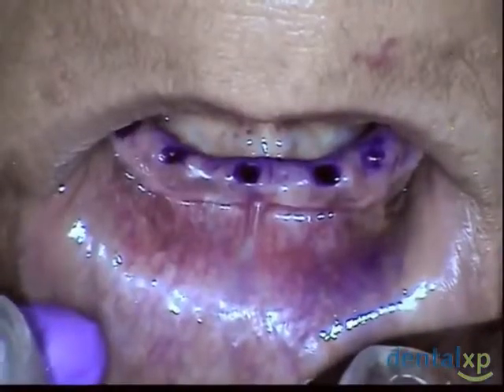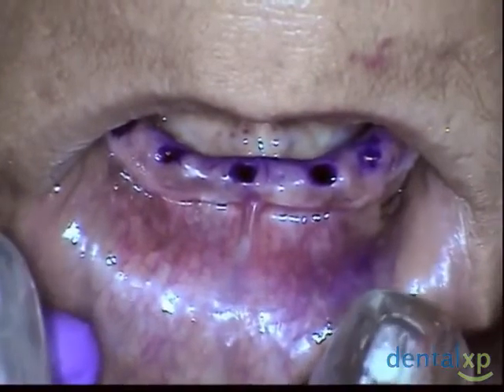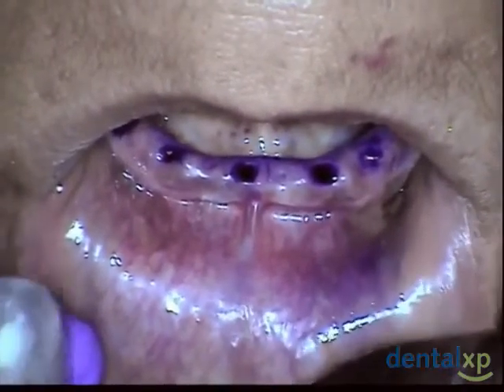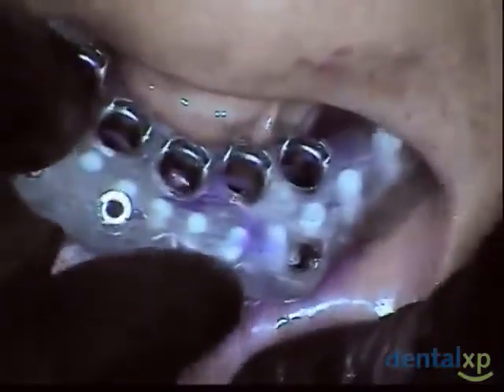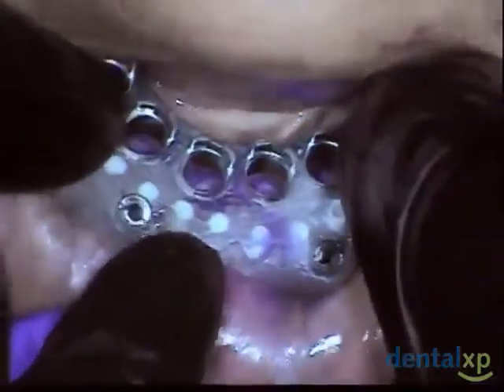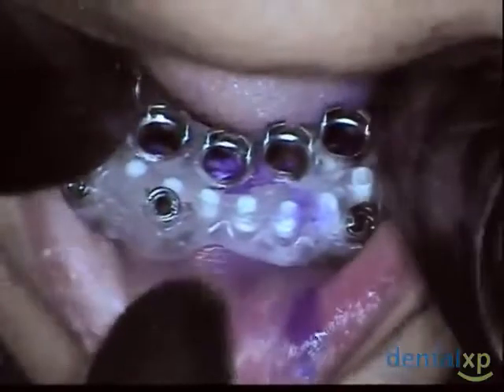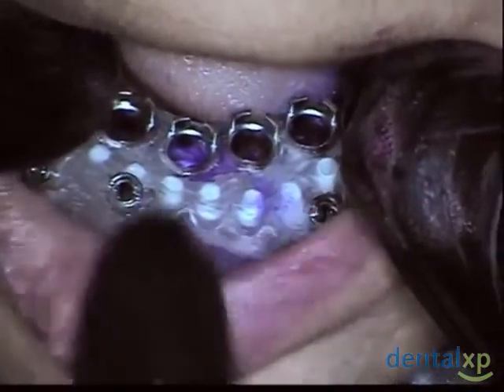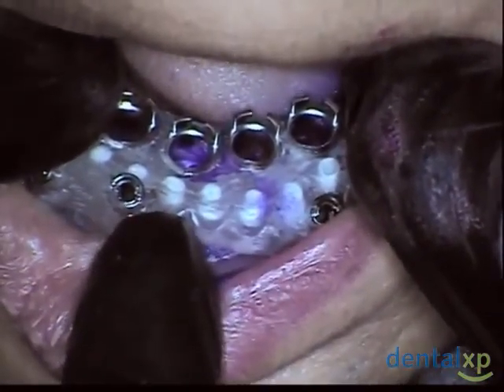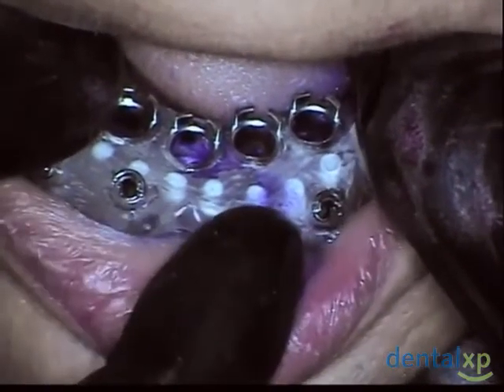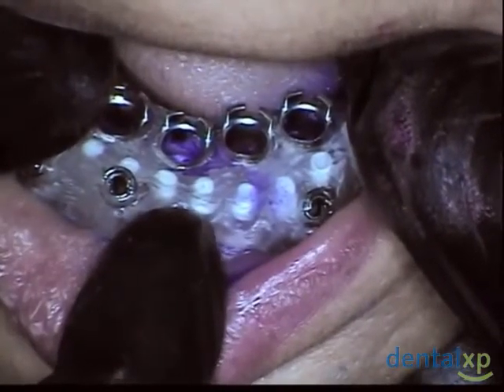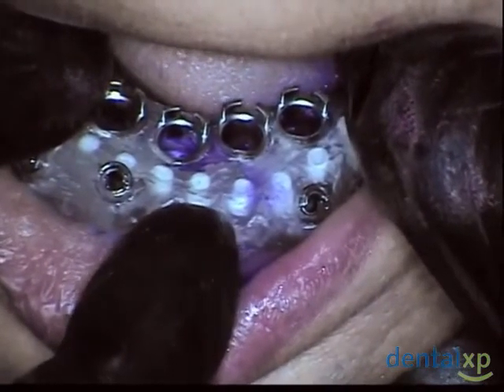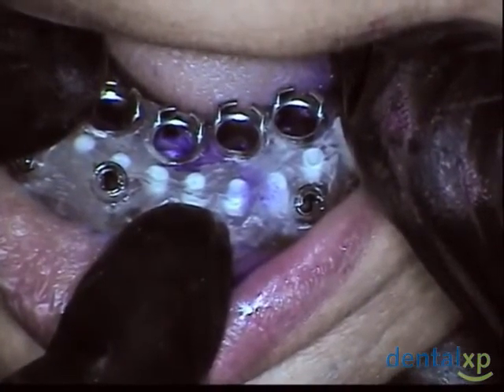This is the lower surgical guide, produced in the same manner. These are wonderful systems if we can stabilize the lower denture, because most people having these procedures done in the lower have no retention at all. It's imperative that we have this surgical guide in the same position it was in when the CT scan was taken — that allows us the accuracy we want. They've provided three pins, created from the surgical guide, that insert into the bone and stabilize the stent in the position the scan was taken, which makes life much easier.